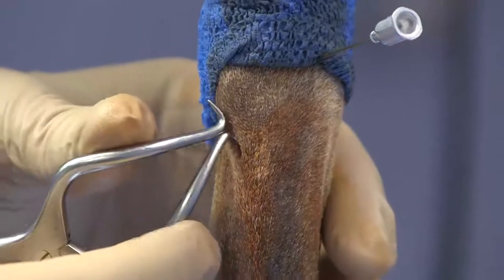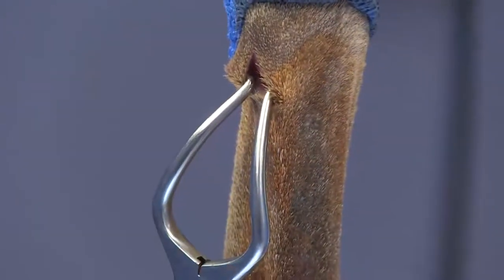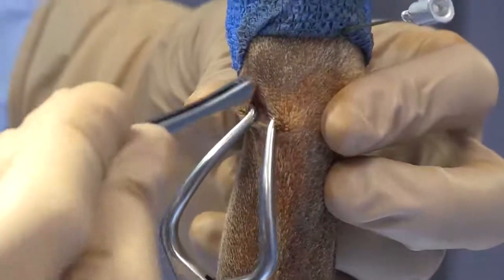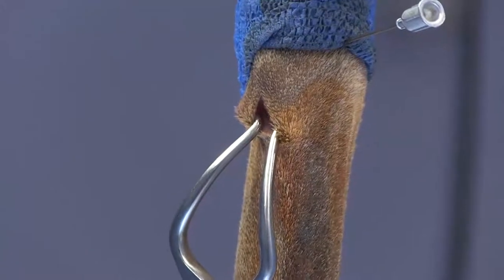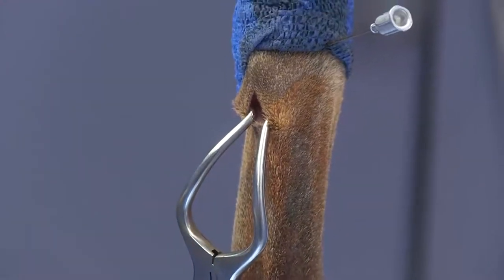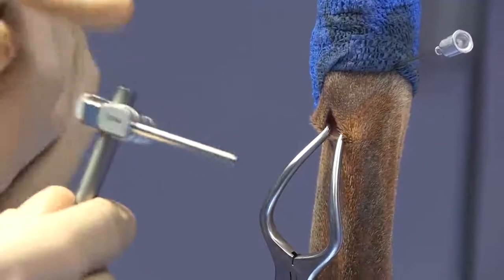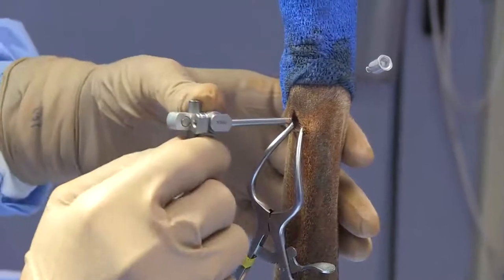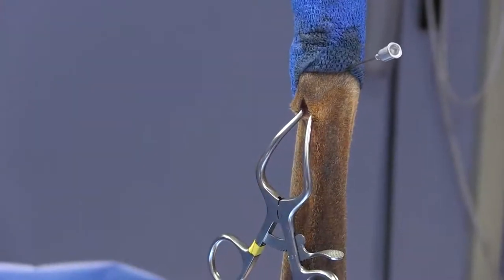We can use a Gelpi retractor placed in the releasing incision to create a nice opening to look right down on the bone. There's such minimal soft tissue distally that the releasing incision was basically right through the skin. This is one of those areas where you don't necessarily need a drill sleeve, but you can use it. By pre-placing it on our connecting rod, it gives us a handle and allows us to position it and get our drill in there.